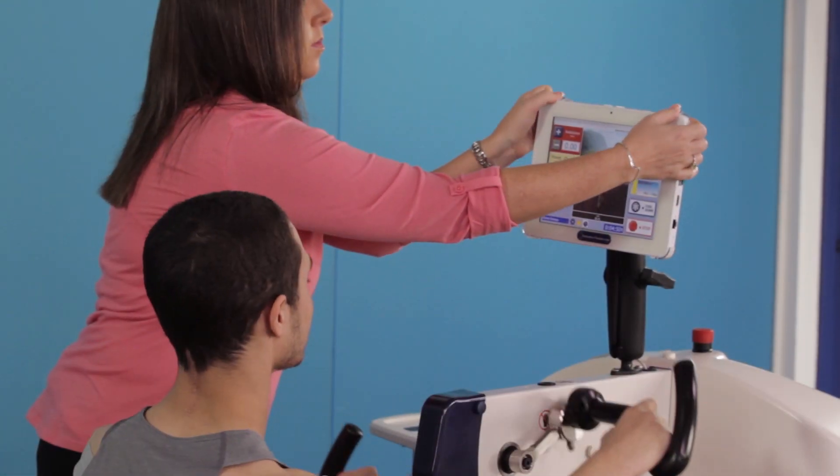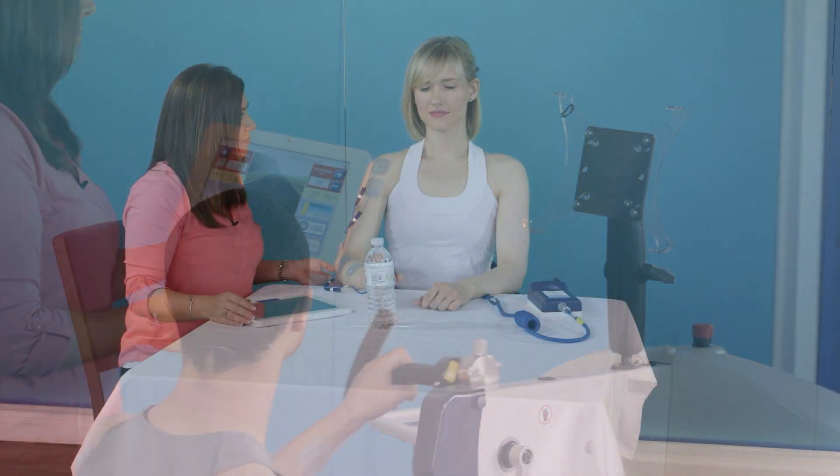The SAGE controller can be easily removed, allowing use of the RT300's FES system stand-alone to facilitate functional activities with a patient.